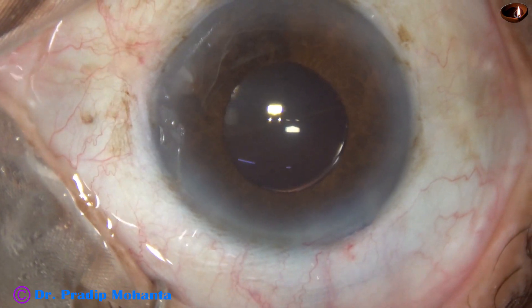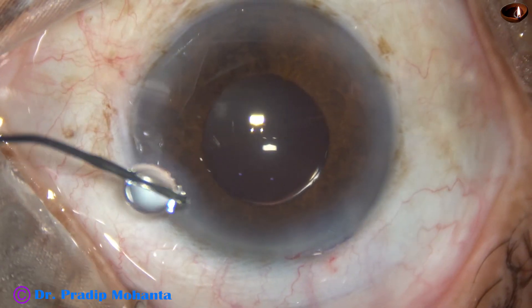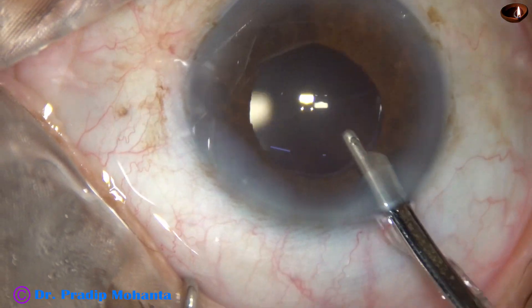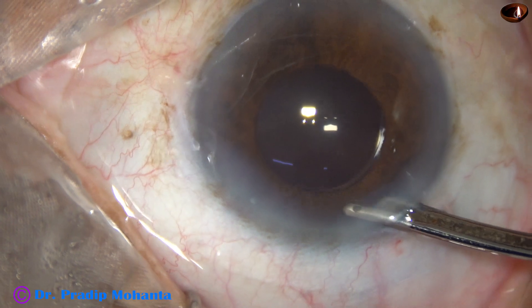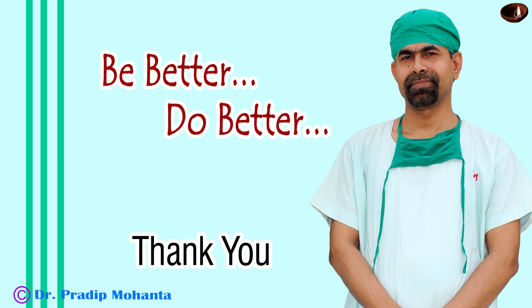This is a bit of moxifloxacin. Now the side port is nicely closed by hydrating the corneal stroma on either side of this stab wound. And this is the final lavage of the anterior chamber. After forming the anterior chamber, the case is concluded. Thank you very much for your attention. Hope this video will help you in developing your surgical skills. Be a great surgeon and serve your patients with love, respect, empathy, and great surgical competence.